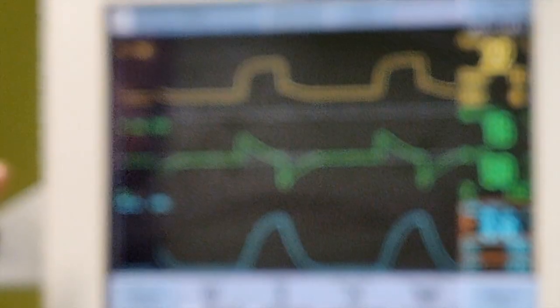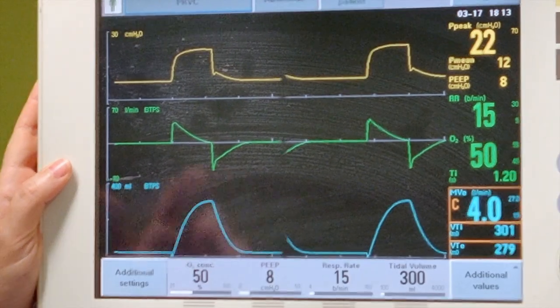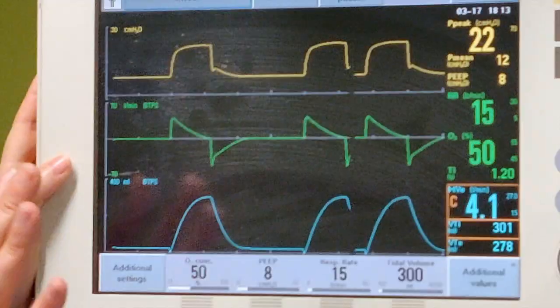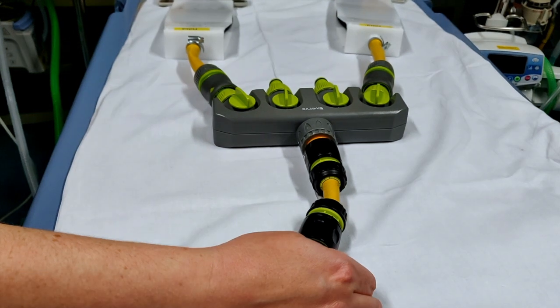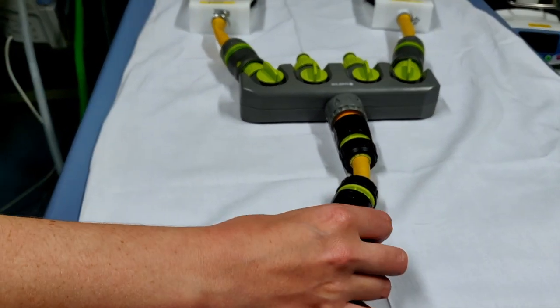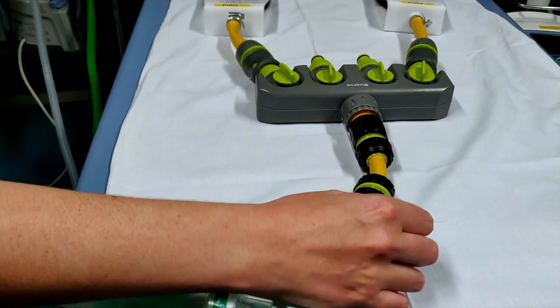Alright? And now, analyzing what will happen when the situations change, we're just going to quickly give an obstruction to the patient, which in pressure control we saw decreases the volume delivered. But here we are targeting the volume. Therefore, we provide the patient with obstruction.